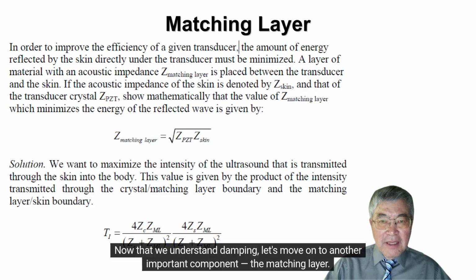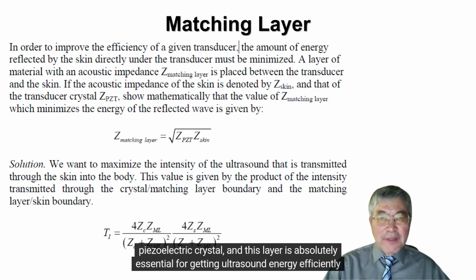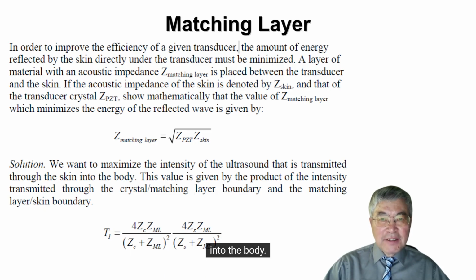Now that we understand damping, let's move on to another important component, the matching layer. You can see from this slide that the transducer structure includes this special layer right in front of the piezoelectric crystal, and this layer is absolutely essential for getting ultrasound energy efficiently into the body.